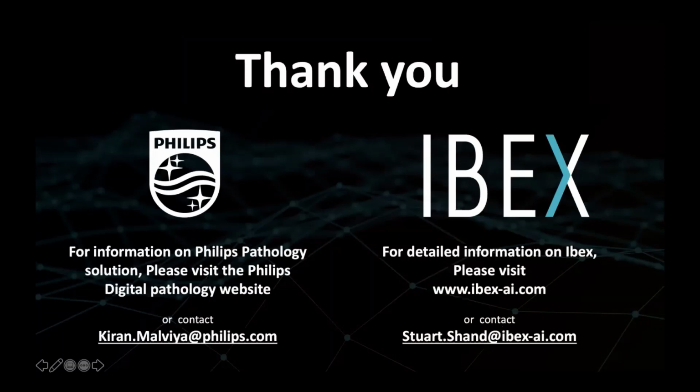Super, thanks, Judith. If I could add just a little word about what Judith said, it's exactly the case for the first read application. We can already fill the whole report with the AI and just change it when we don't agree with the AI, or if the AI cannot fill some points, the first read application makes the report, and after that it communicates with the LIMS. So it's already done.